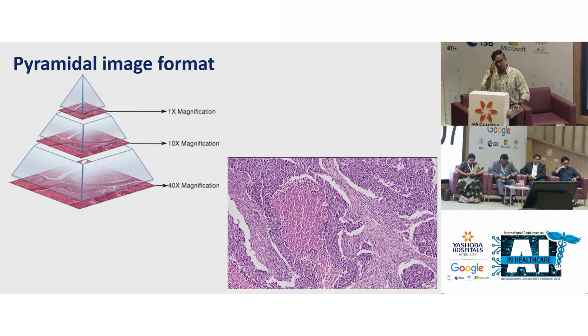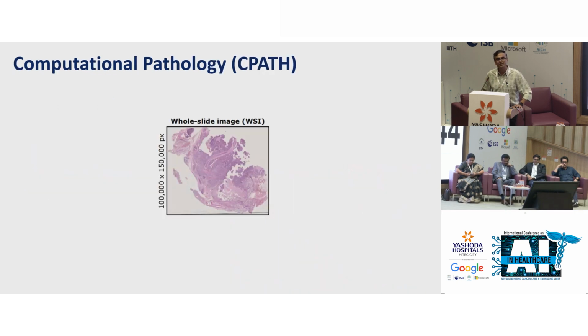It's also an interesting image in the sense that you can see it at multiple resolutions. Therefore, you have different morphological features that you can visualize and arrive at some kind of conclusion, right? This is the kind of dataset you will use when you adopt digital pathology. Once you have digital pathology, we are talking about bringing in computers to interpret those images, and this is where we have been discussing the role of AI, and whether AI will replace pathologists or pathologists who know AI will replace pathologists. So I'm giving you the flavor of how pathology will be disrupted in this space of AI in healthcare.